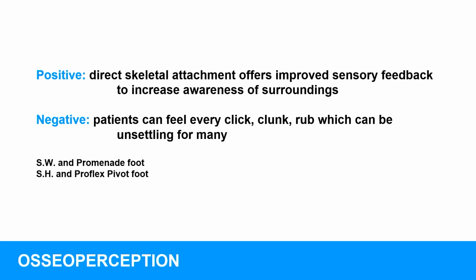We did fit a patient with a ProFlex pivot foot from Arizona. Wonderful gentleman in a socket. He absolutely loved that foot. When we fit him in with osseointegration, he said, "I can't tolerate it." I think the energy storage rebound, the vibratory motion was driving him crazy. So you will discover that components have a huge effect on discomfort.